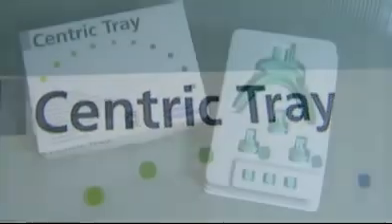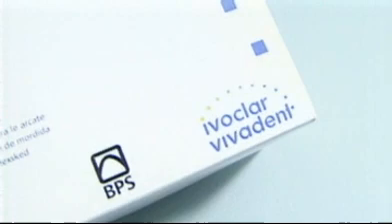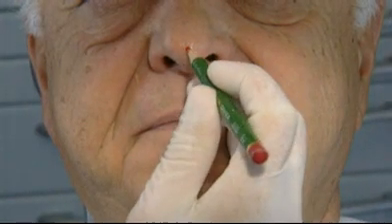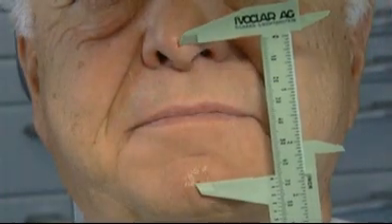Centric tray. The centric tray permits the transfer of the occlusal position to the individual impressions. In addition, the tray allows the physiological unity of the stomatognathic system to be maintained. To record the occlusal height, apply marks on the nose and chin of the patient prior to impression taking. Record the distance between the marks with a sliding caliper.